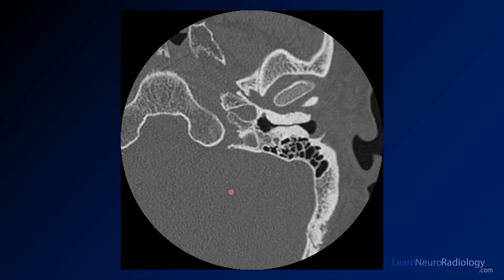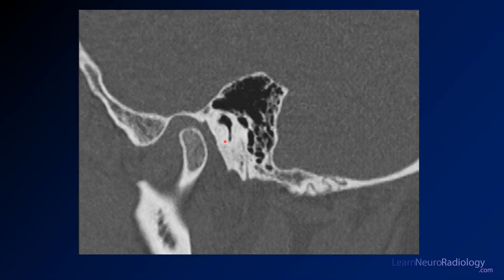When you look at the left side you see the same finding — massive proliferation of bone, very little in terms of the external auditory canal. You have a little wisp of the tympanic membrane which is displaced a little bit, but a marked proliferation of bone. Again on the sagittals you see the same finding.